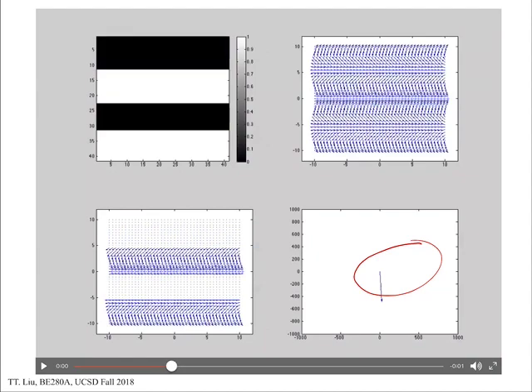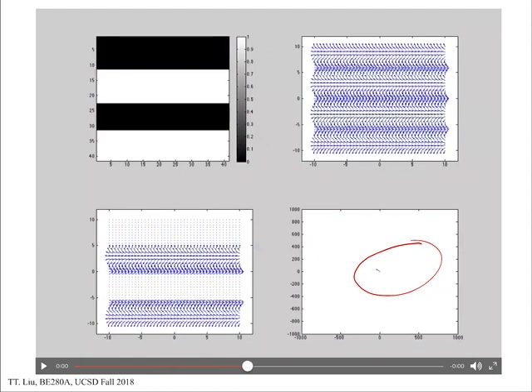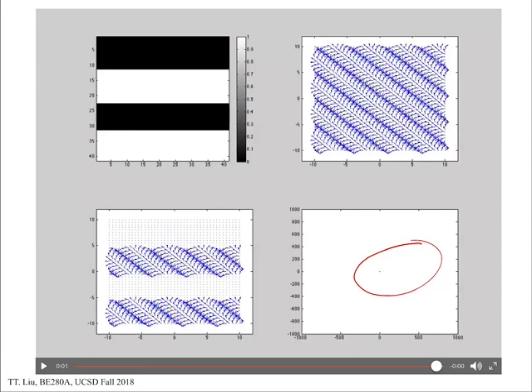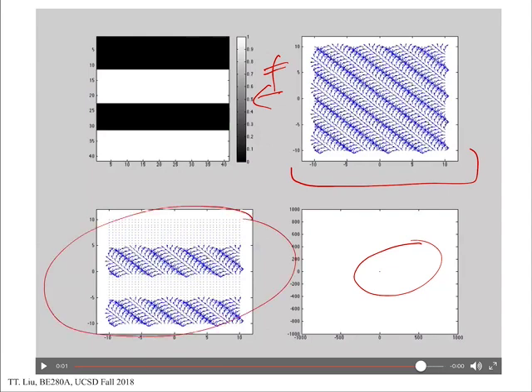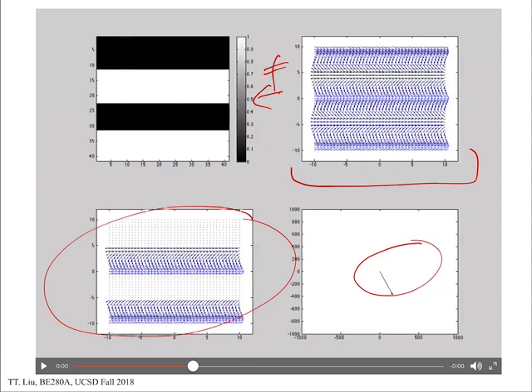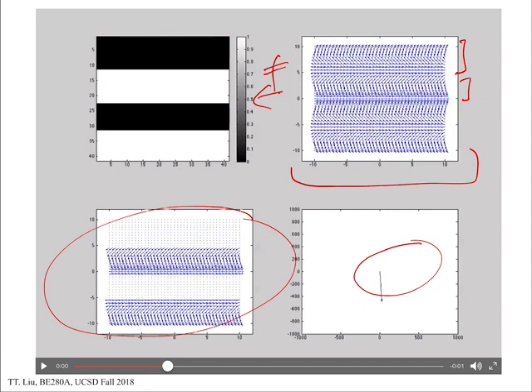As I keep moving my phasor pattern along, it goes up, it goes down, it goes up, it goes down. For example, at the end here, this phasor pattern is not really a good match for my object. These don't match very well, and therefore the summation of all this is pretty small. Let's see where we find a fairly good match. Let's go back here. Okay, there's a fairly good match, and you can start to see this pattern of variation matching my object a little better, so I'm getting a bigger summation. I think it's pretty big there. The basic idea is that anytime you have a fairly good match between your phasor pattern and your object, the Fourier transform should be fairly large.